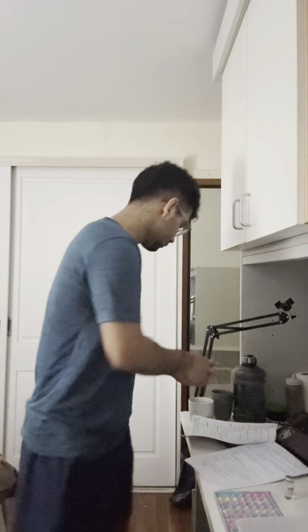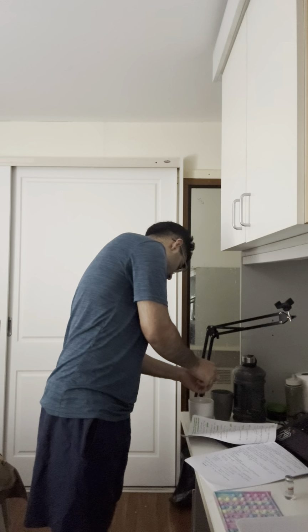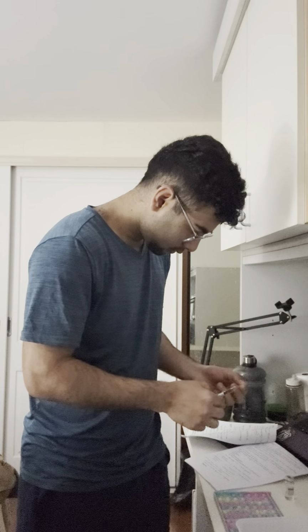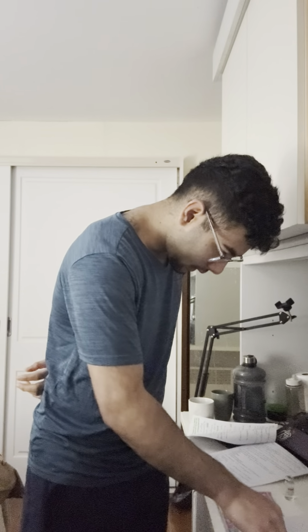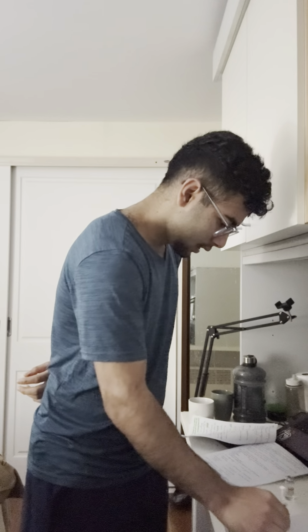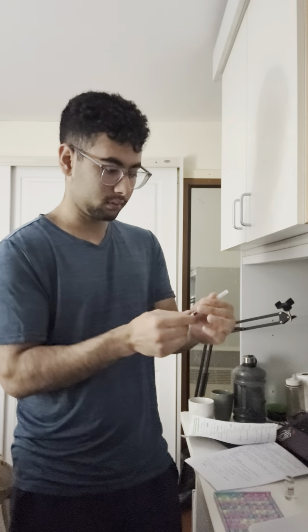Right, so it's 4 units, and never cap with your hand. Always do it like this. Never cap with your hand, because this is crucial, because most people prick themselves when they do that by themselves. Right, so you can lock it.